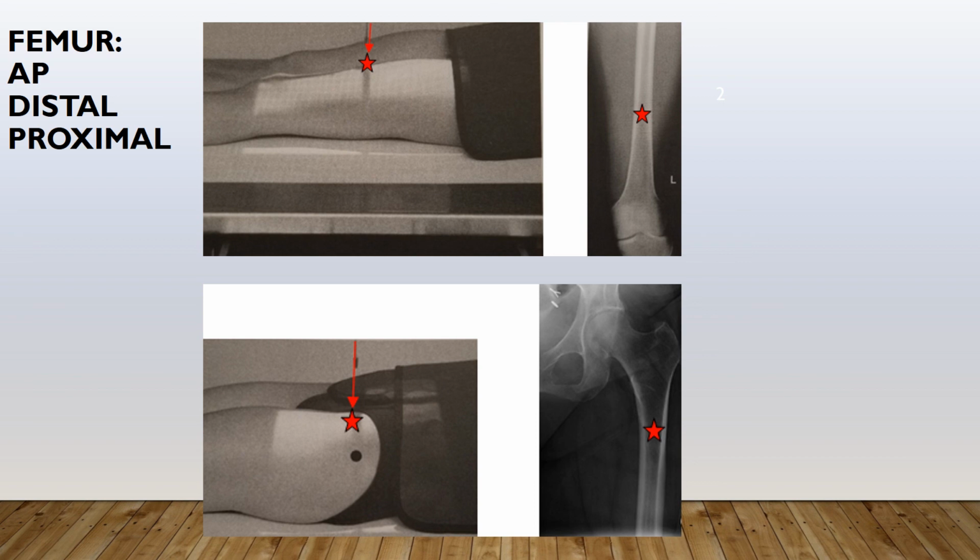When we are placing the image receptor into the bucky, then we will need to utilize a grid technique, which will be between 70 and 80 kVp. If we are x-raying the patient tabletop and we are using an image receptor without a grid, then we can stay at the 50 to 65 kVp range.